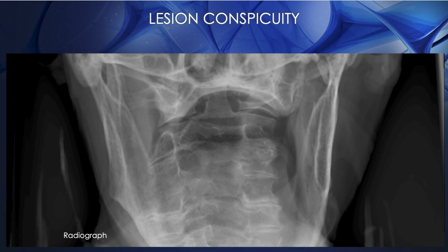But let's talk about some clinical cases, because it really depends on how those images actually look. I'm going to show you a variety of cases, almost all of which were taken with the Nano-X ARC, and a few which were not, just to illustrate what are some of the applications for tomosynthesis. This is the case that I'd like to start with, because it does a good job of illustrating how the structural noise we see in radiographs can so easily obscure an important finding.